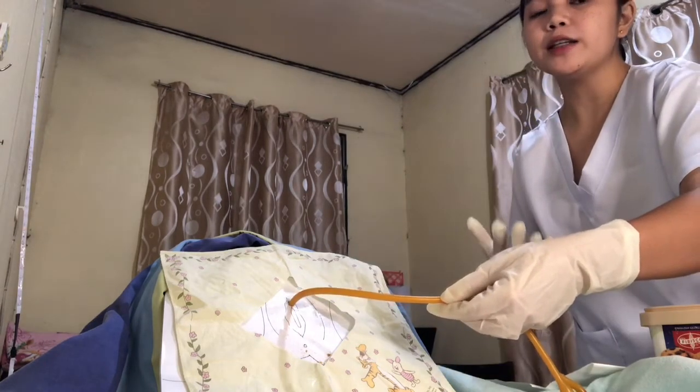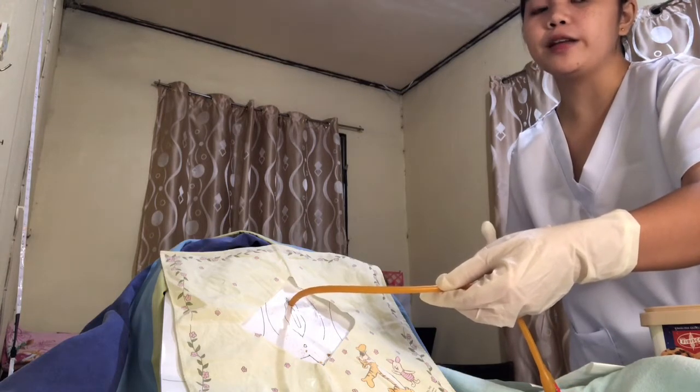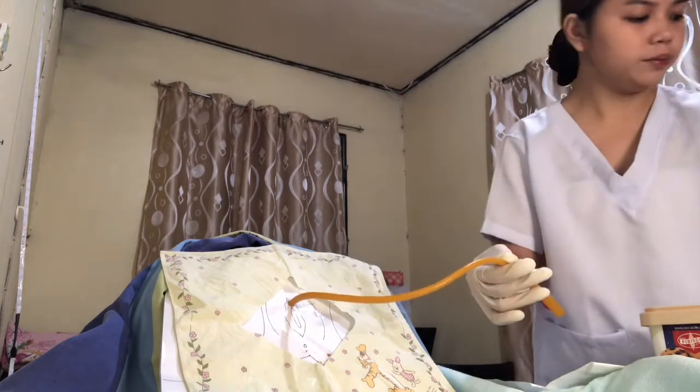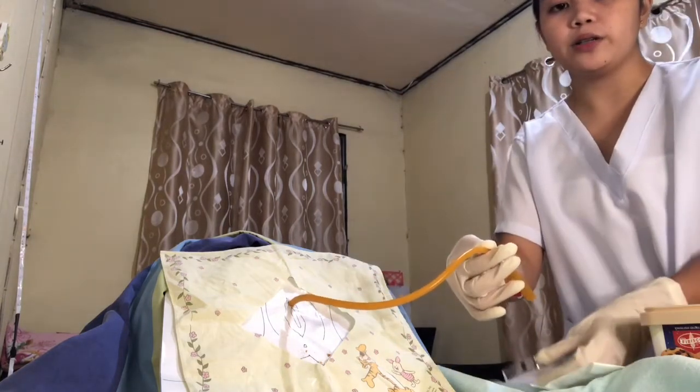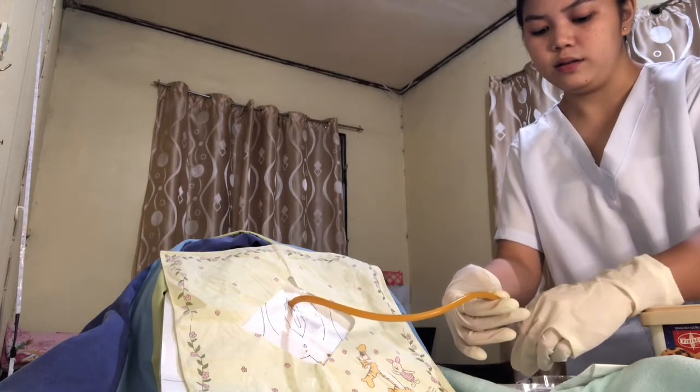So if a specimen is to be collected, pinch the catheter with the thumb and the finger while placing the specimen container in position. Allow 20 to 30 cc of urine to flow into the specimen bottle, not touching the catheter to the bottle. Urine will flow off the catheter if the lumen is not included, thus the purpose will be defeated, and this maintains sterility. So we will get the specimen holder. This is an improvised specimen holder, and we'll put it here.